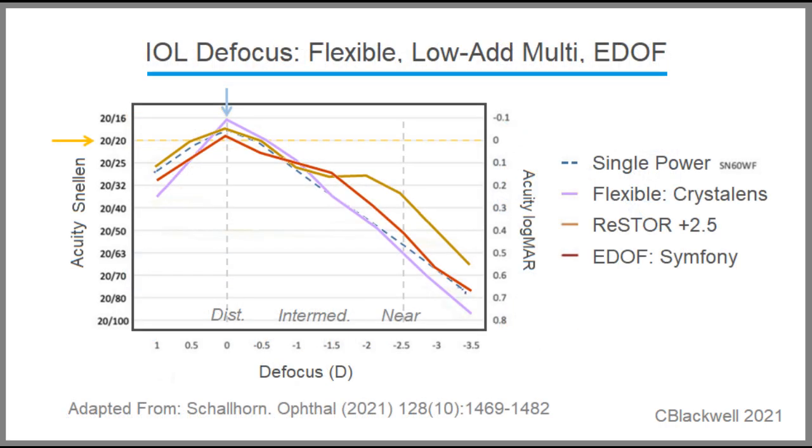To measure how successful the lenses are at providing good focus at different distances, one tool is the, quote, defocus curve. Don't be intimidated by the name. I'll explain how this works. It will give you a good picture of how the lenses compare in function.